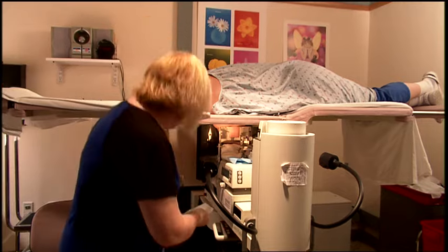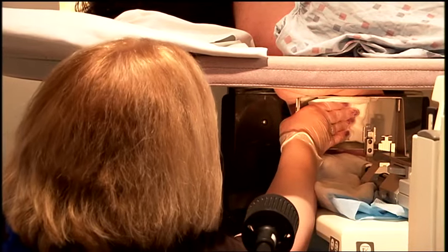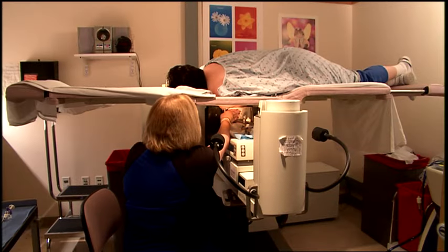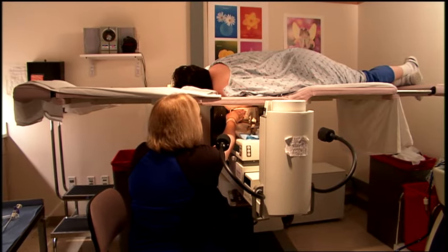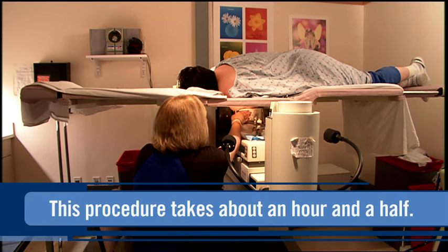The biopsy instruments are removed and a bandage is placed over the small incision site. Patients may be given an ice pack to keep the swelling down. Sometimes a compression bandage is wrapped around the chest to minimize bruising. The entire procedure usually takes about an hour and a half.